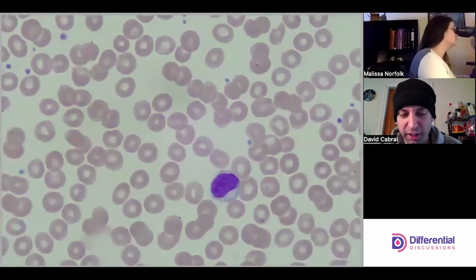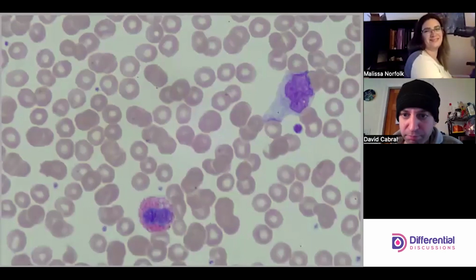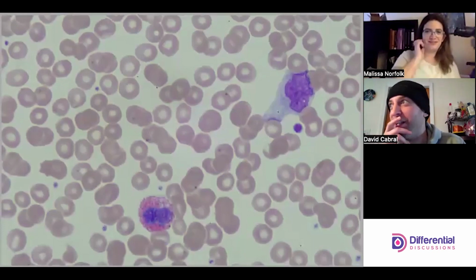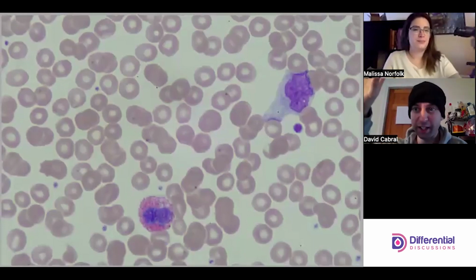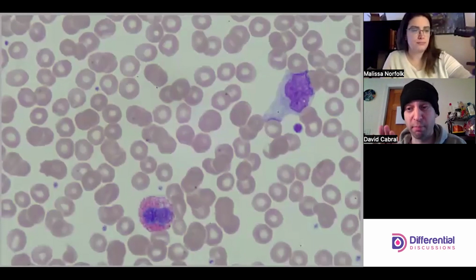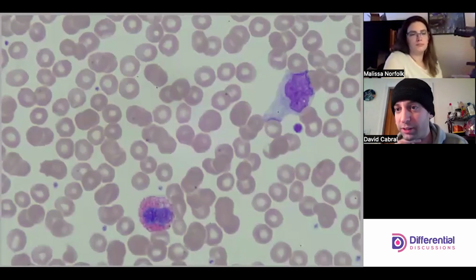Not too terribly concerning. It's funny, the ones that are the most close to normal might take me the most time to review. So we get another EO, and we have what looks like a monocyte doing his stretchy thing. But Dave, it's blue right here. I know, it is. So it's an excellent heuristic that when a cell has pseudopod extension and touching stuff, and when you get that deep blue color at that point of contact, it's like a good hint or push towards lymph. But there's too many other things about this cell that tells me it's not a lymph.